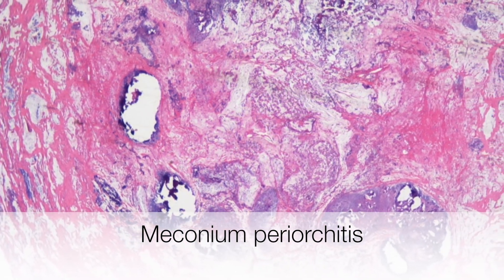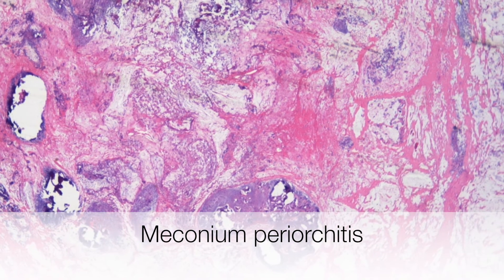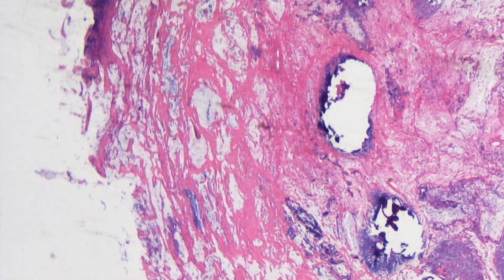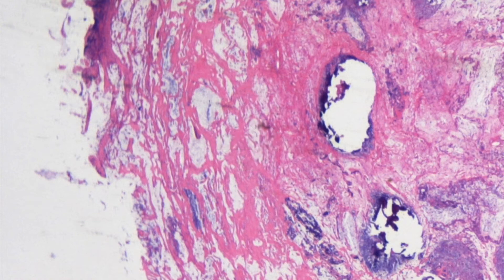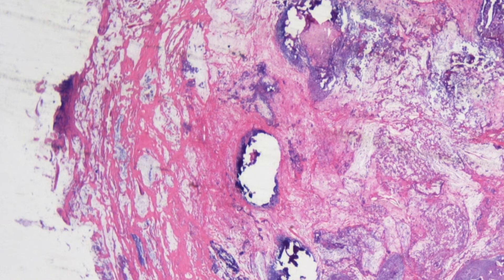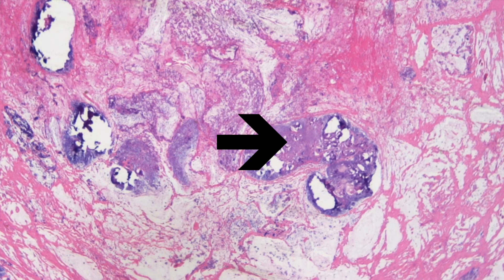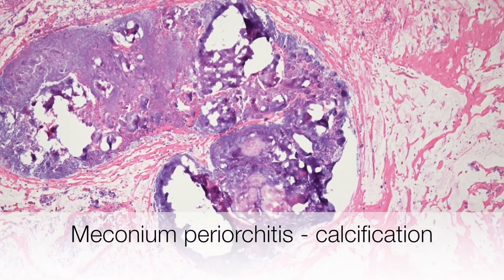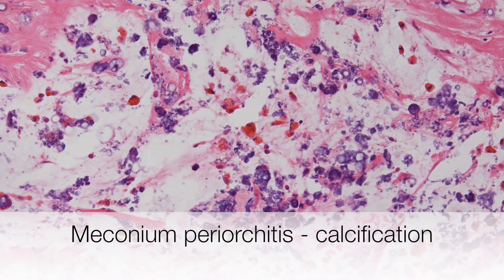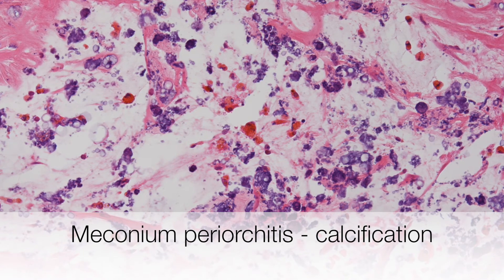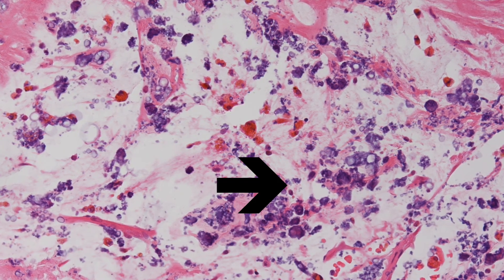This is a low power view of meconium periorchitis. There are three features to recognise. At this power you can see the pink areas — that is the foci of fibrosis. The whitish areas are the pools of mucus or myxoid material from the meconium. And the purple areas are the foci of calcification. On higher power, this area shows the foci of microcalcification — these are the small purple nodules.